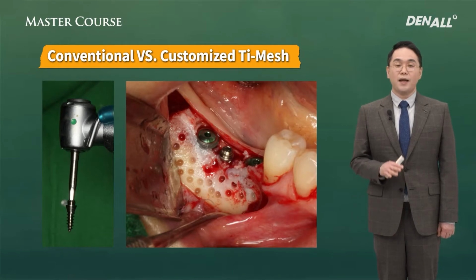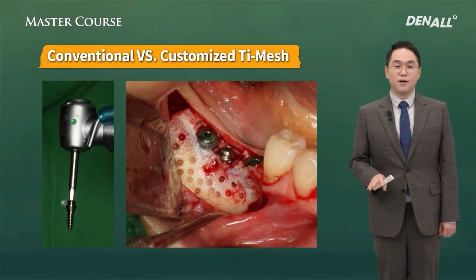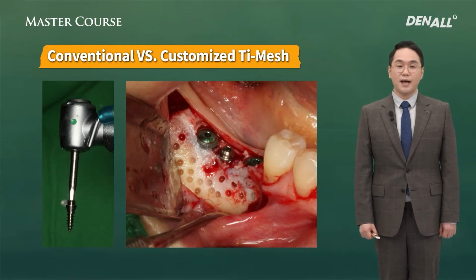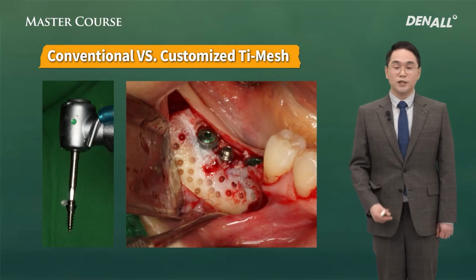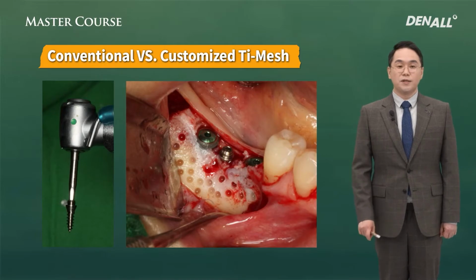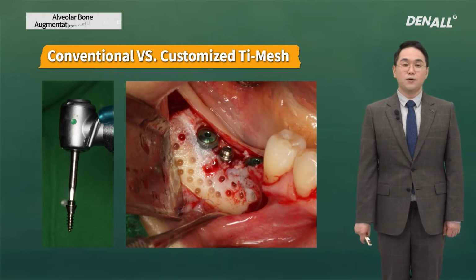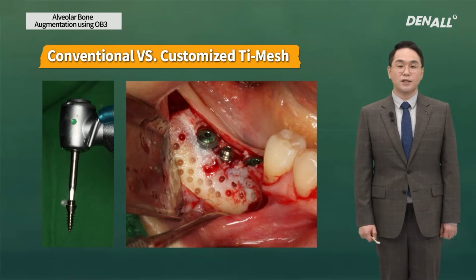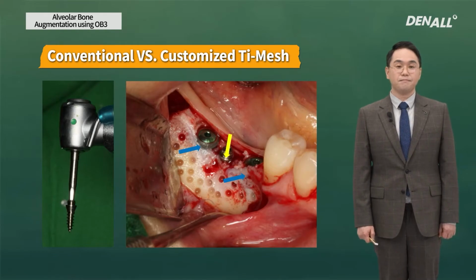The tenting screw's head where the Jawbuilder will be mounted should be superiorly positioned than the cover screws of the adjacent implants. Only that way the overall alveolar bone can be augmented vertically. And the bone graft materials are positioned on the cortical bone where blood supply is poor, so cortical perforation is done.